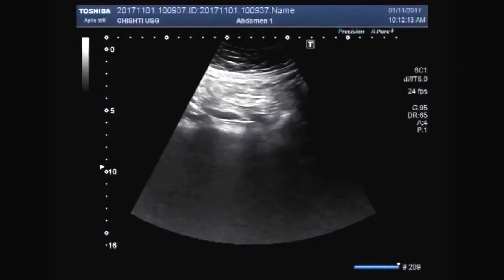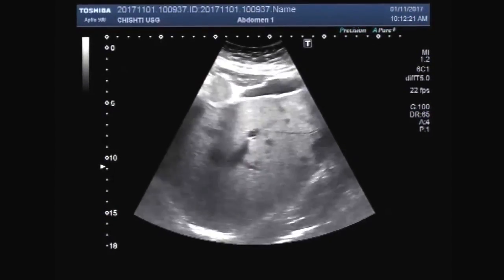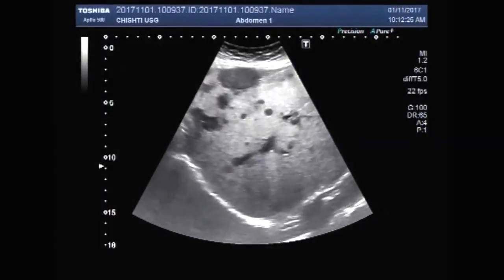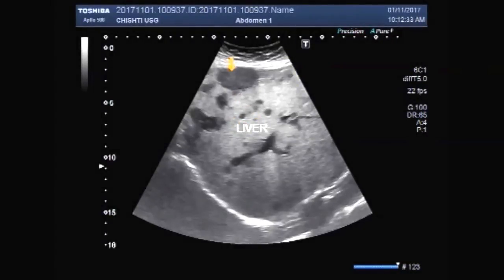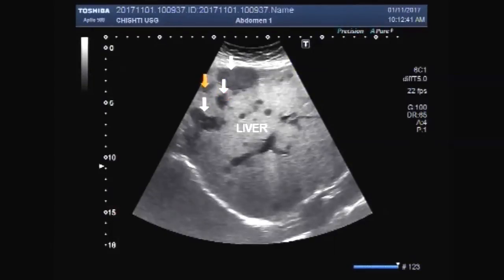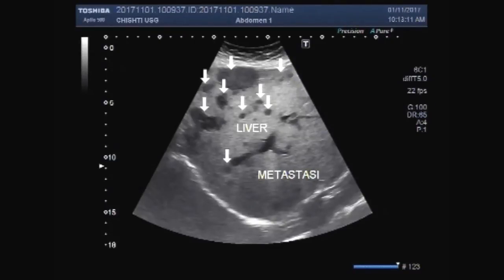Dear viewers, I hope you are all fine. Today you will see an ultrasound video showing multiple masses in the liver. You can see masses of varying sizes — the larger one is lying in the upper border of the liver. There are multiple masses: small, very small ones, and others of medium size. The masses are seen in the whole parenchyma of the liver. These are metastases, round to oval in shape.